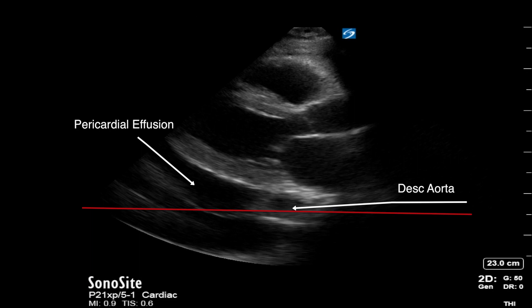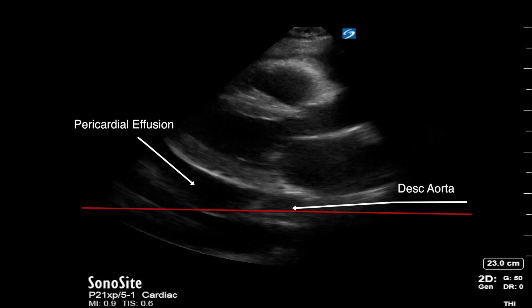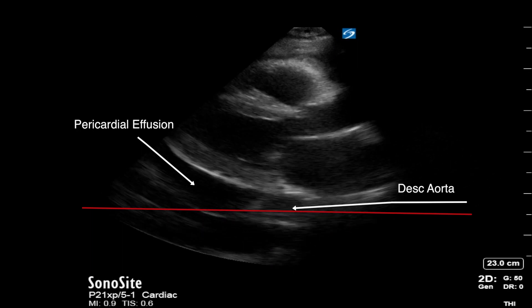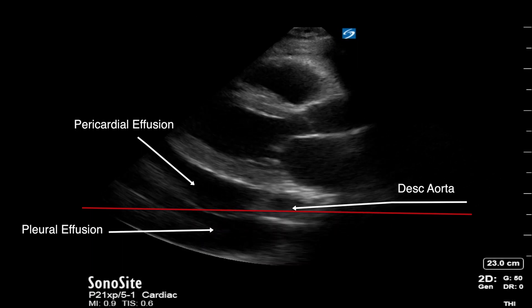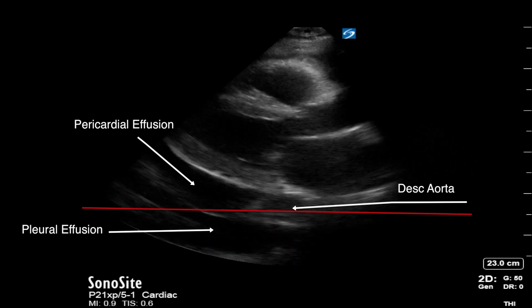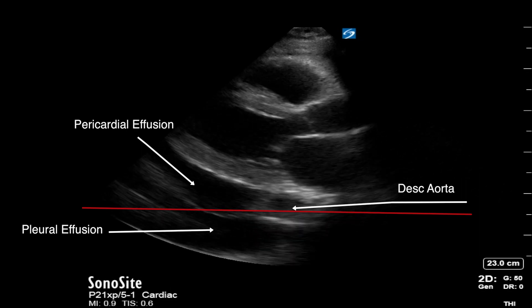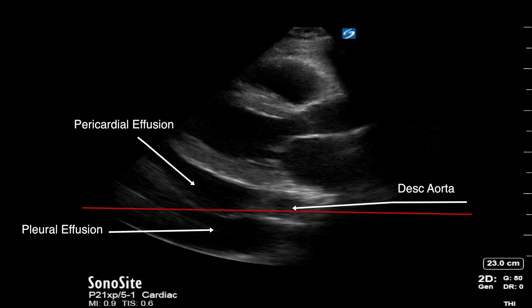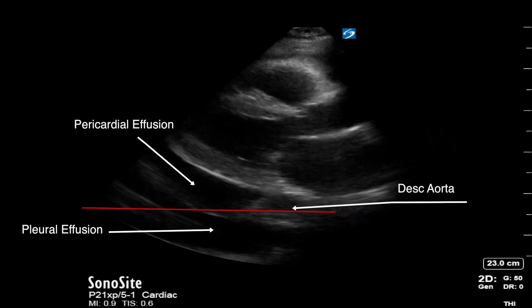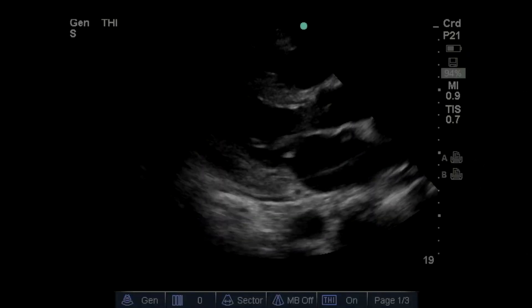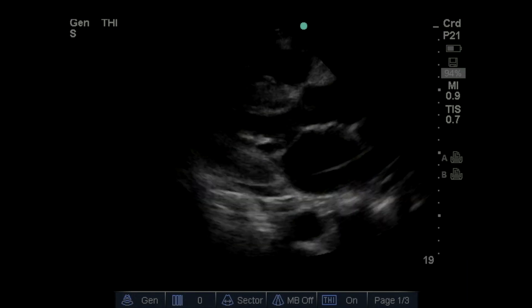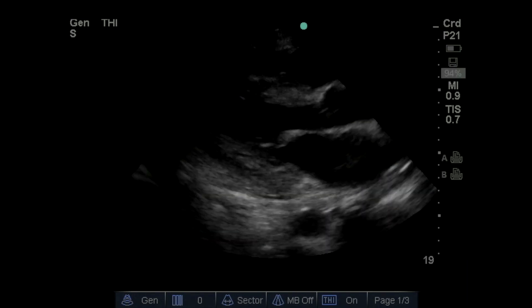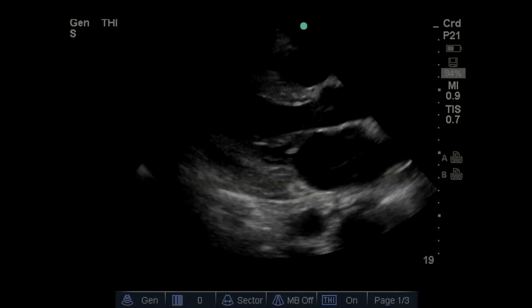One tip in this view is if you see anechoic fluid anterior to the descending aorta, you know this is pericardial effusion. If you see anechoic fluid posterior or at the level of the descending aorta, this often identifies pleural effusion. In this last clip, in the parasternal long axis view, you can see a hyperdynamic left ventricle. This often suggests a septic patient or a patient with hypovolemia.